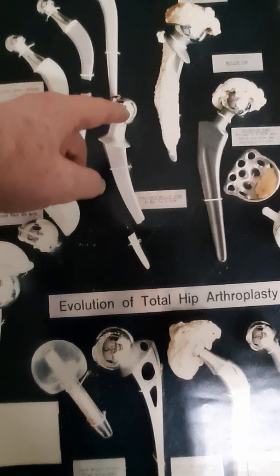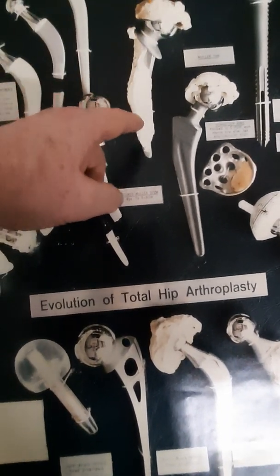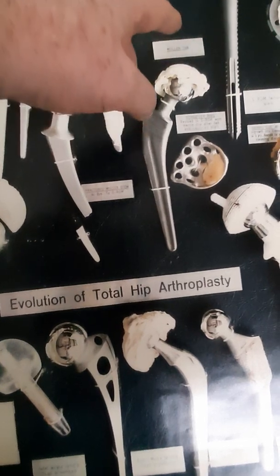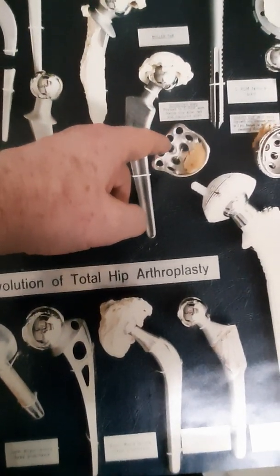Here it is, 32mm head, again broken. And here it is with the cement mantle. When you do a revision, you can lift that out. So between the cement and the bone, just lift it out. Here's another Muller with the cement around the acetabular component. Here's a special cage for the acetabulum.